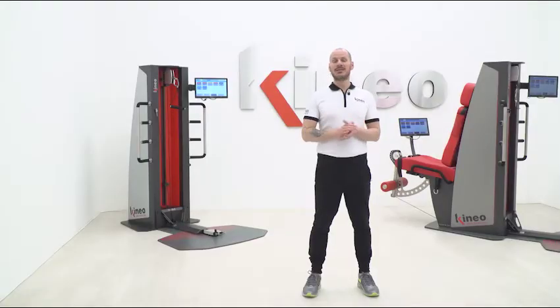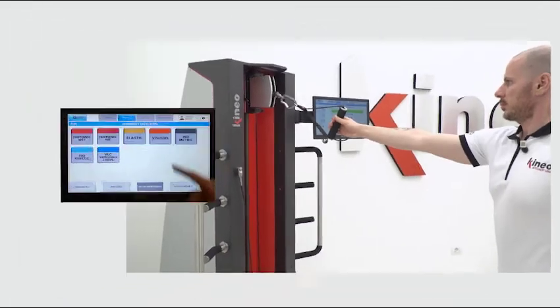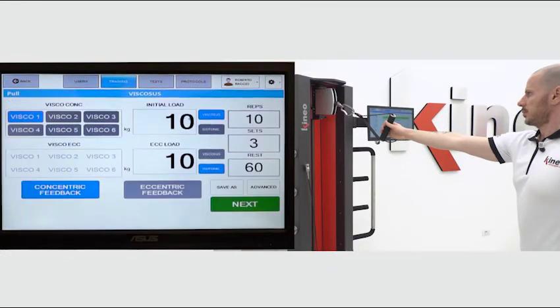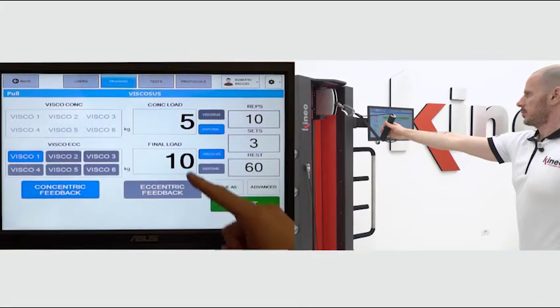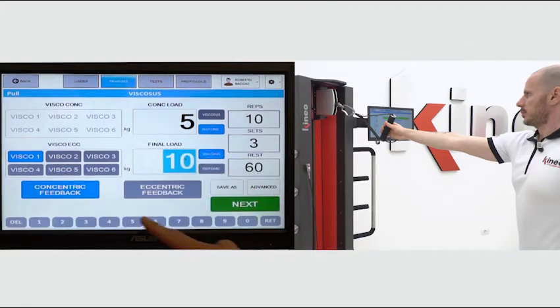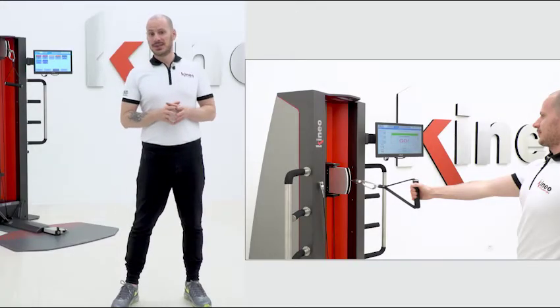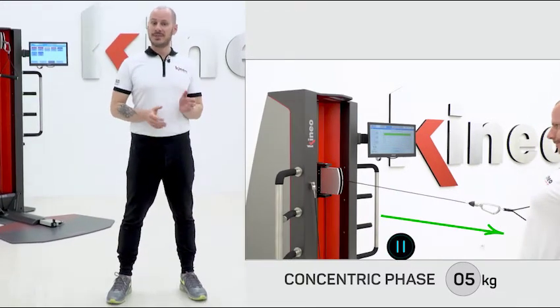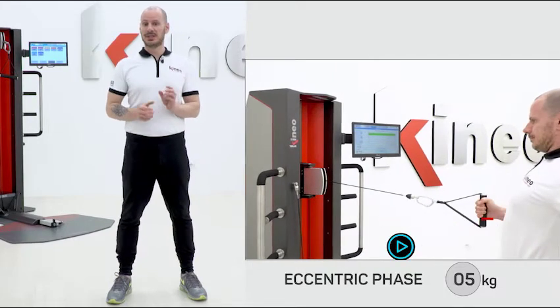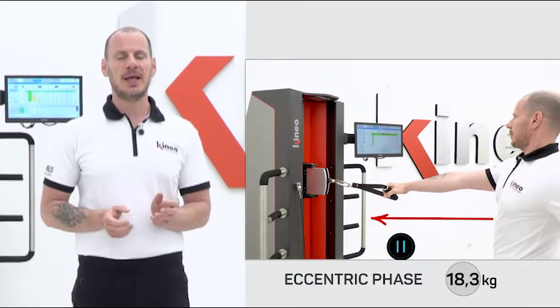The Viscous Mode can also be applied in the eccentric phase. In a pulley exercise, we set an isotonic load in the concentric phase, for example 5 kg, and a viscous one in the eccentric phase, for example 30 kg with viscosity at 6. As we start the exercise, we can see that the concentric phase maintains 5 kg, and in the return phase, if I try to resist the load and move slowly, Kineo gives me a load of 18.3 kg.